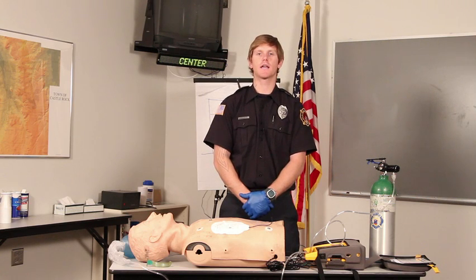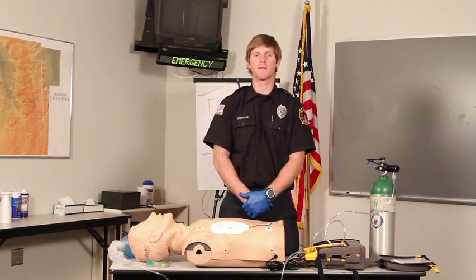After you deliver the shock, you want to make sure that either your partner or bystanders continue CPR for 2 minutes. While your partner or bystander is doing CPR for 2 minutes, you're going to be in charge of managing the patient's airway.